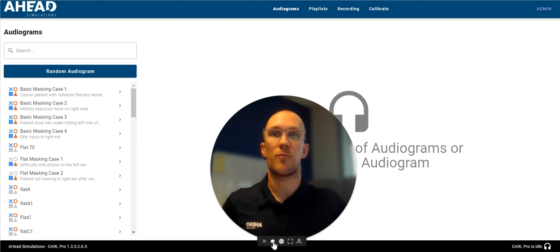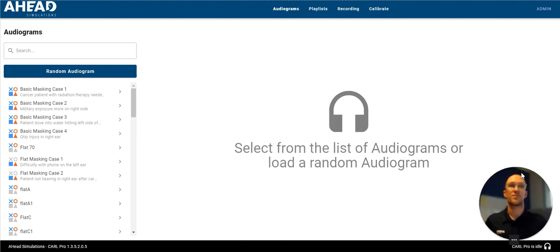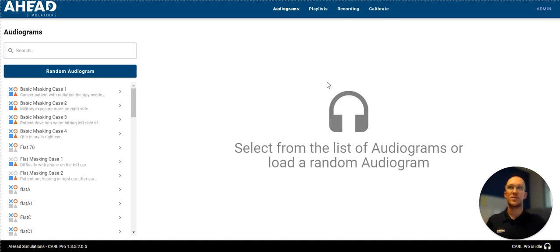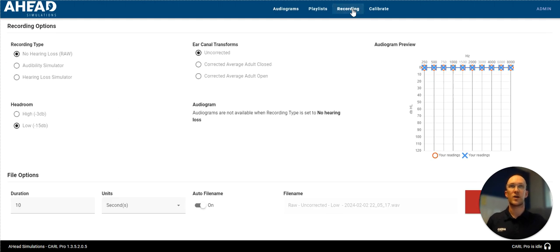So here we're going to go back over to the interface. And at the top right is your menu. This is what you see when you first log on to your Carl Pro for the first time. When I click recording, this is the screen that you're going to see.